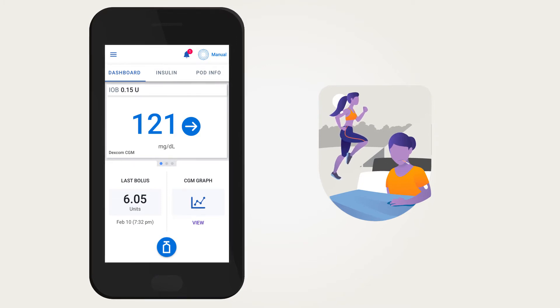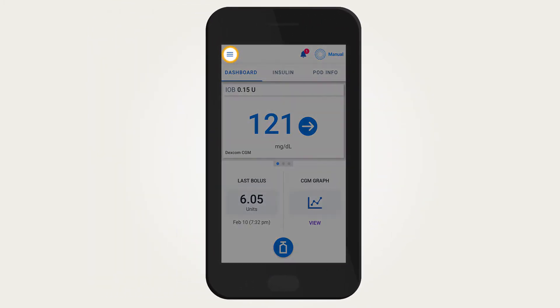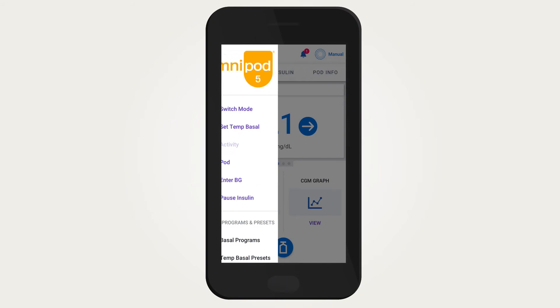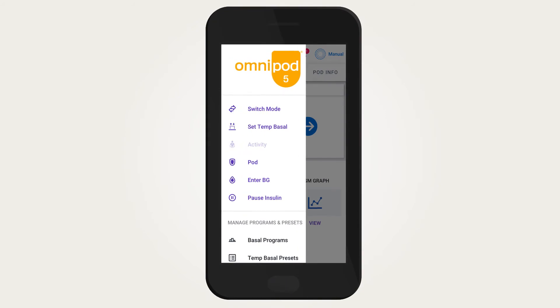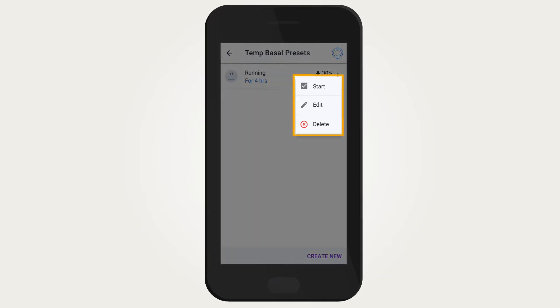To create or edit a temp basal preset, tap the menu button. Once the menu expands, tap Temp Basal Presets. You will then see any previously saved temp basal presets. With those saved, you can tap on the Options icon to start, edit, or delete.